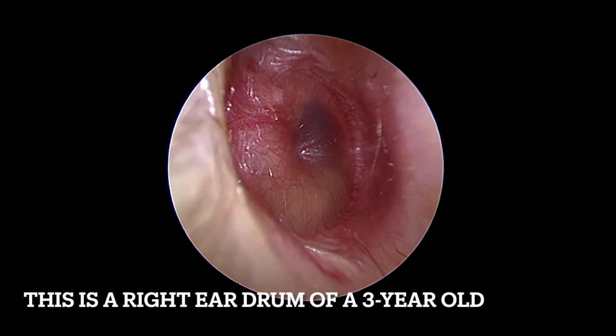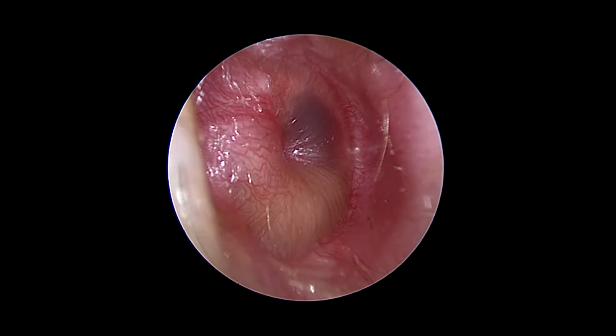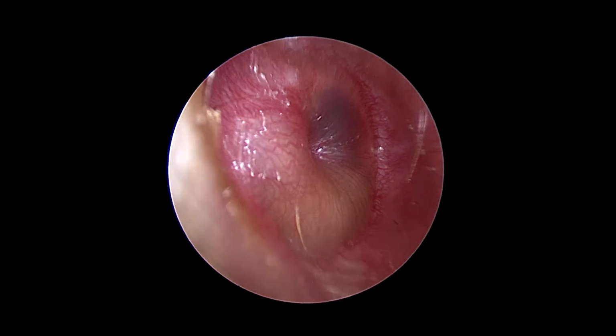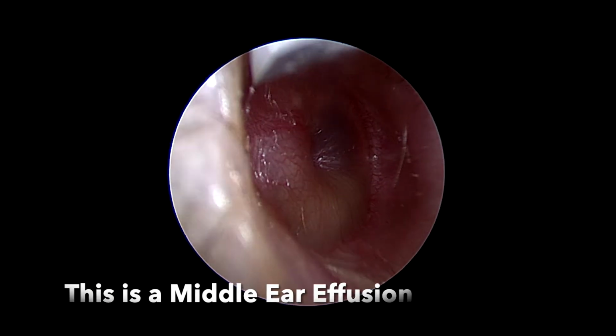What's up guys, I'm in the operating room. Let me show you how I'm going to do some ear tubes. So once the patient is under anesthesia, I take a look with the operating microscope or with a sinus endoscope. This is a sinus endoscope. The eardrum is about 1 centimeter and this view is magnified by about 10x. I intentionally left this video in real time so you could see how quick it could be.